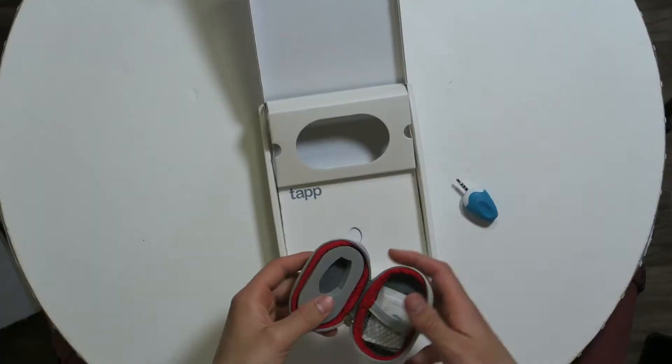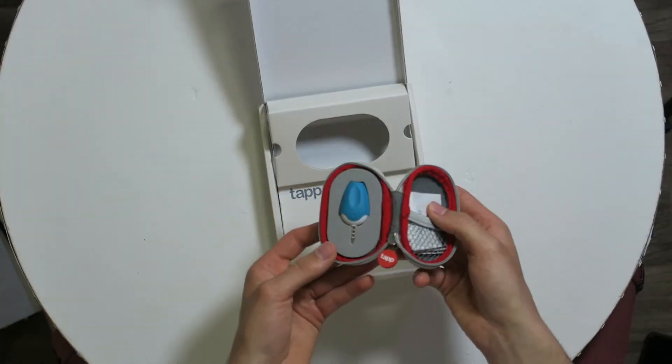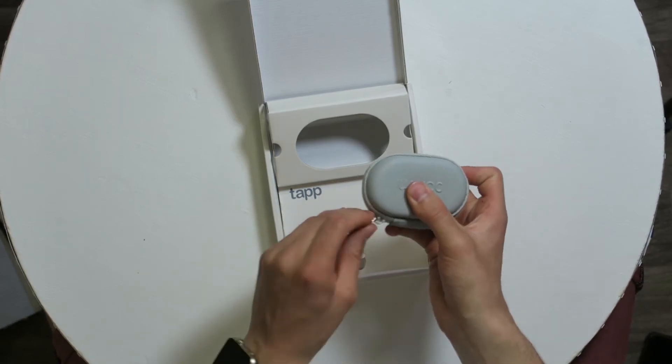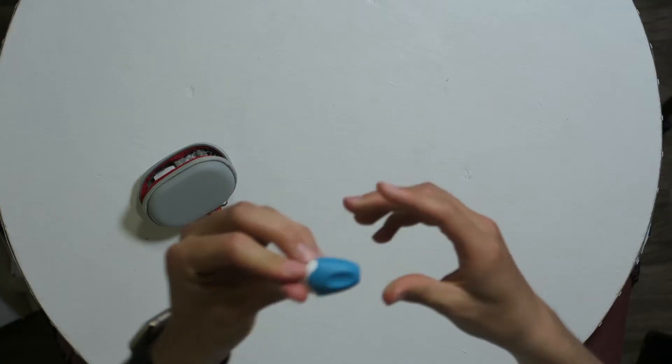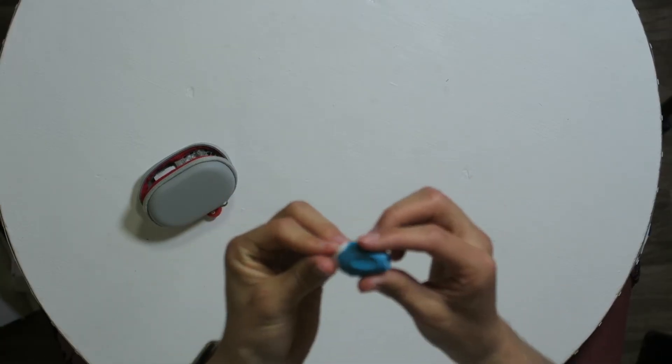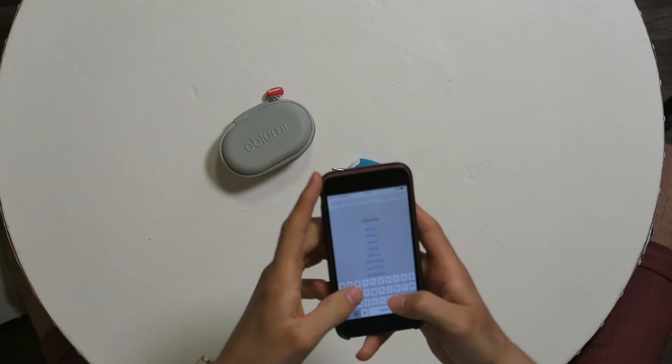This is how you put it in the back — very neat, you can take it with you wherever you want. There's actually a plug you put on to measure on your forehead, and if you take this off you can put it in your ear. I'm going to download the Obloomy Tap app from the app store.